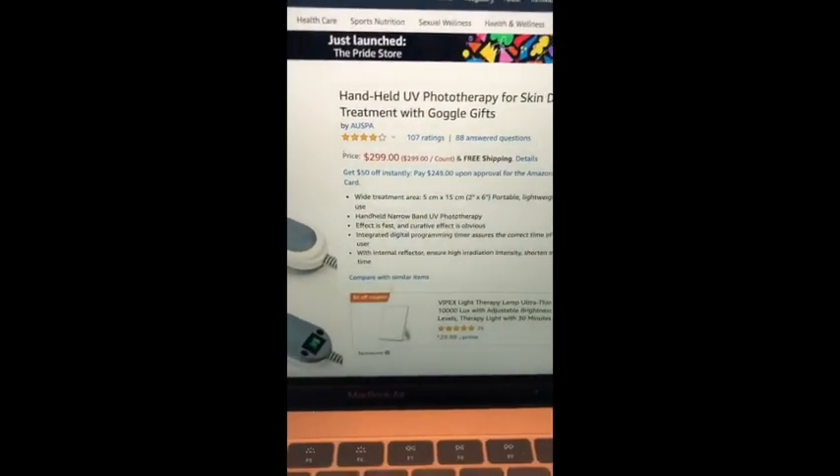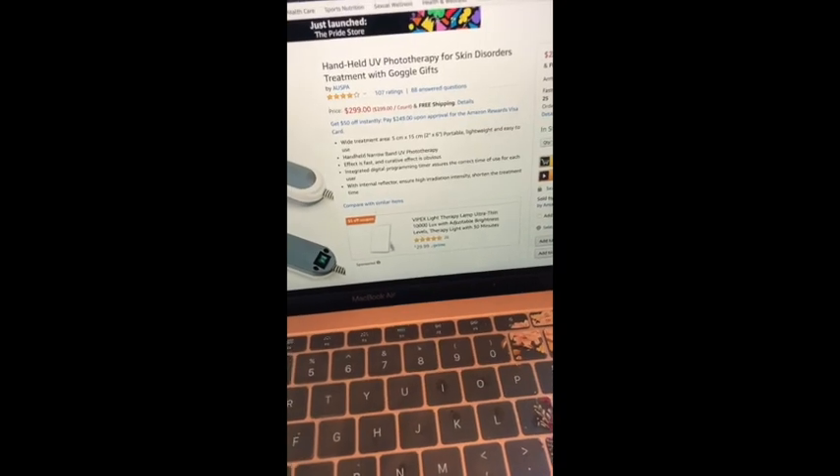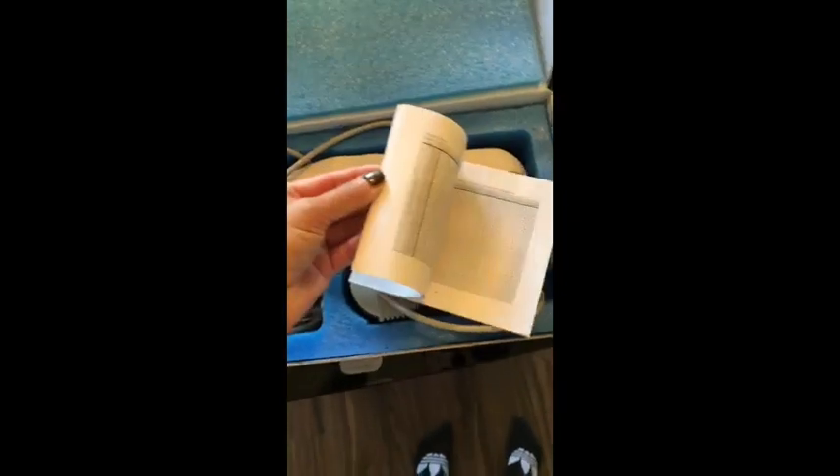This is the actual product — it's by Kernel, the KN4003. It retails for $300 plus tax unfortunately. I got it off Amazon. I read a lot of reviews about it; it has some pretty good reviews and some good information. I highly recommend you guys do your own research and find what works for you.